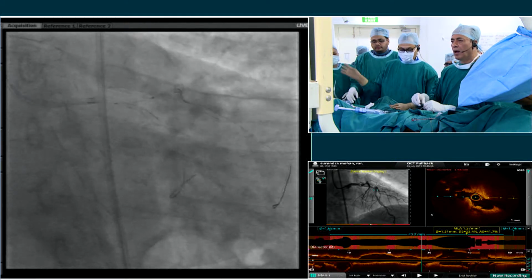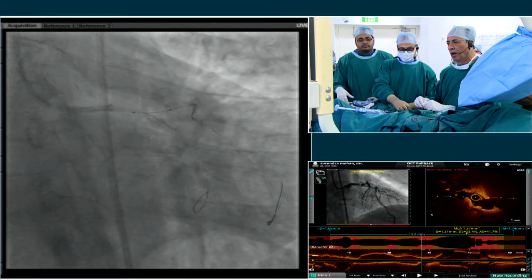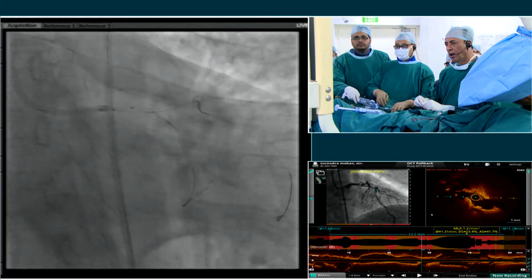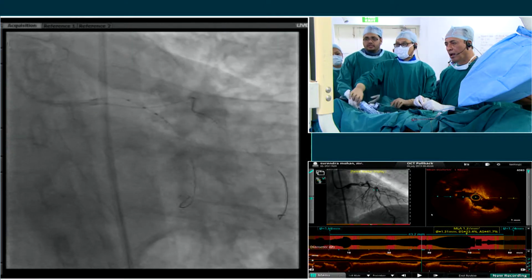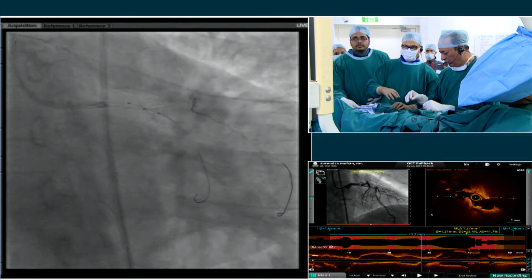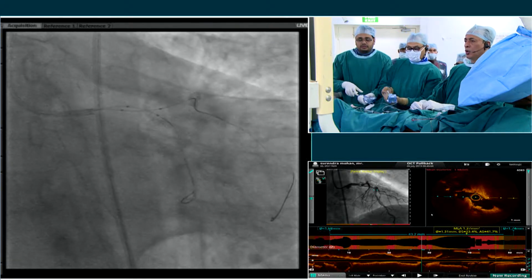or not something that's favorable, what's your second favorite stent strategy? And if there was not much disease, for example, in the origin of the circumflex, do people prefer a provisional approach with a TAP or a reverse culotte? So maybe that's the second question. If you're taking a provisional approach because the side branch is large but not diseased, who prefers TAP? And who would prefer to just finish off a culotte?